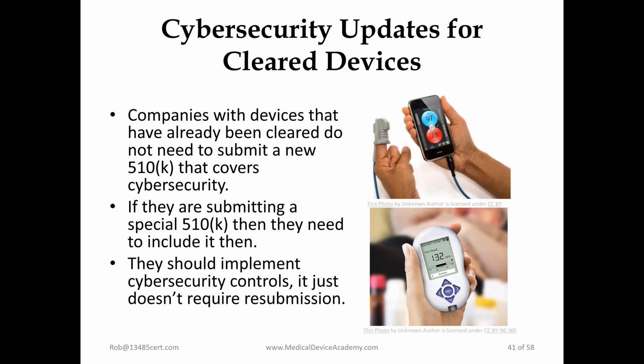So these are some cybersecurity updates for cleared devices. If your device is already cleared, you are allowed to make cybersecurity updates that don't specifically require a 510K. That's one of the specific questions that we'll see when we get into evaluating changes. But companies with devices that have already been cleared do not need to submit a new 510K specifically for cybersecurity updates. If you're submitting a special 510K, or a catch-up 510K, then you should include those updates. But if it's only for cybersecurity, you don't require resubmission. Next slide, please.